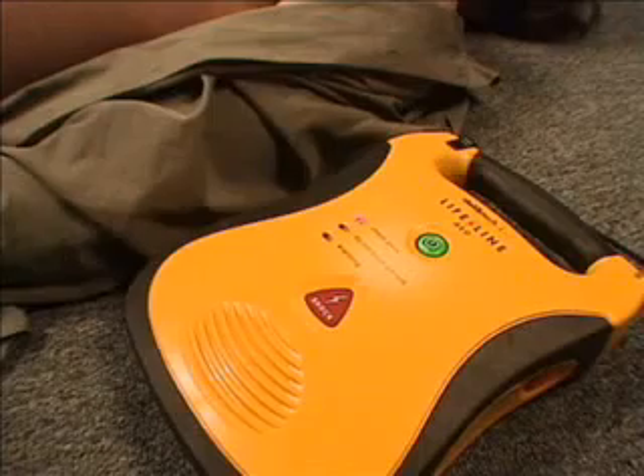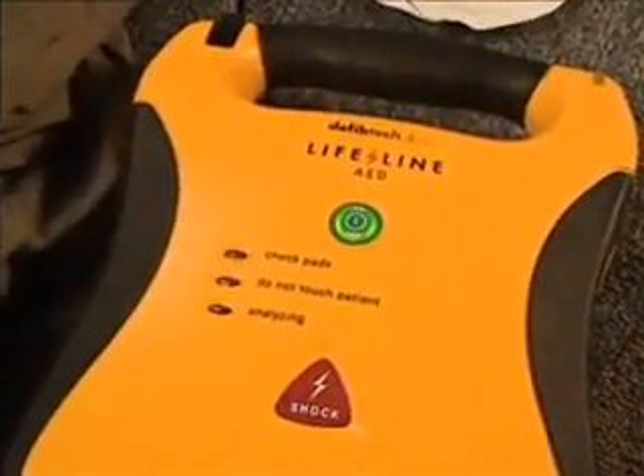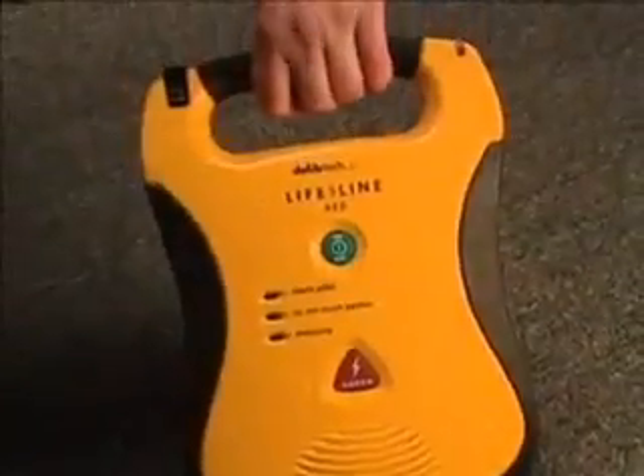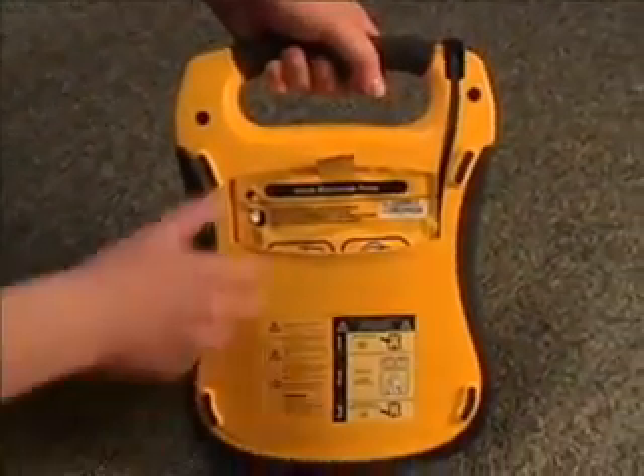Call for help. Remove pads from the package and the back of the unit. Apply pads to the patient's bare chest as shown. The Lifeline AED should have been stored with the pads already pre-connected and in the pad storage pouch on the back of the unit.